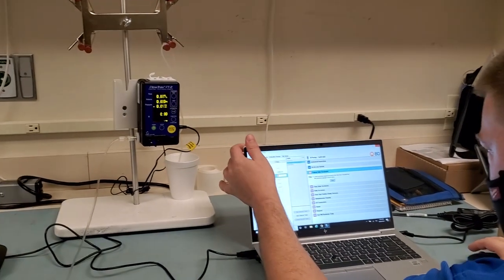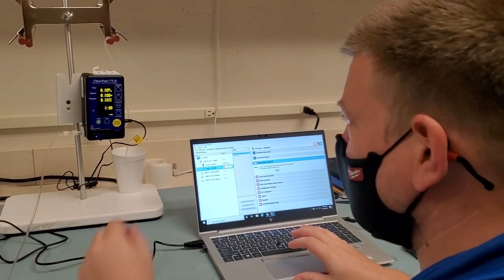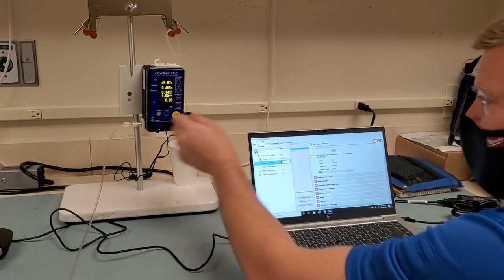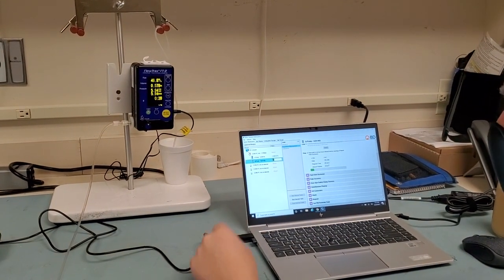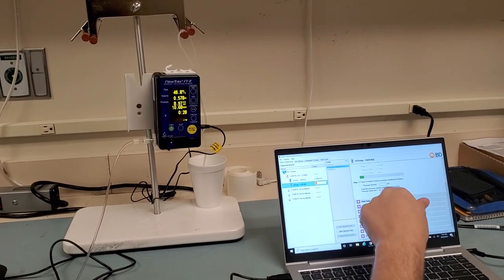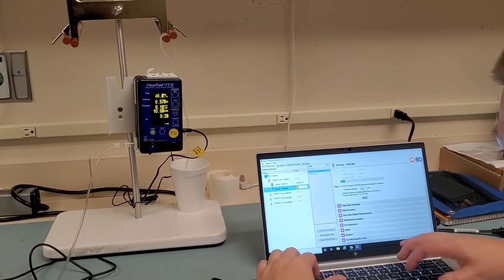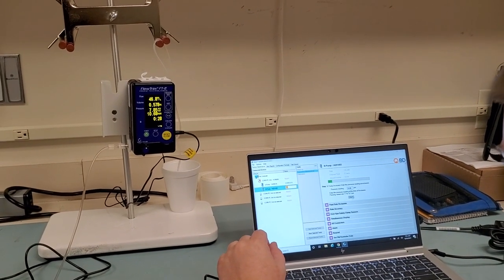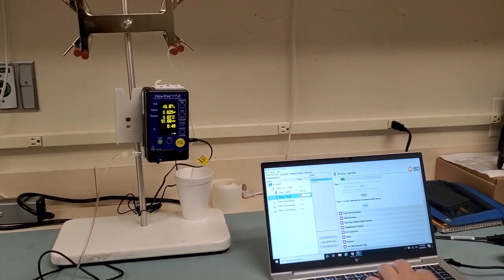I'm on patient side occlusion. Let's see, I'm just gonna use this guy. This is load prime set. Okay, so right now my occlusion's open. Okay, now once we get 0.4, then we can occlude it. And here's the pressure. See, it says 10.68. We gotta get between 7.7 and 12.7, that's perfect. 10.68. We'll click on next. So now we can go ahead and open the occlusion back up. It's a very important step.